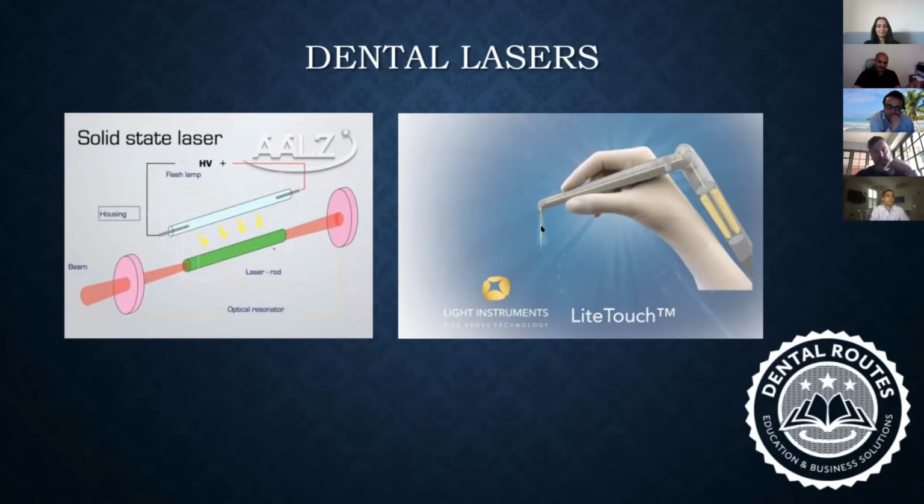And now you have that wonderful spot of energy that's coming out of that tip, and we can now use it for anything that we think it's ready to be used for. Guys, so I've explained about lasers. I've explained how light is expanded in terms of wavelength. And we have just gone through how a laser is made in a handpiece.